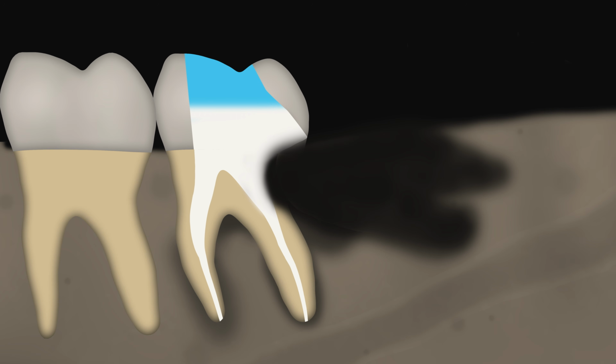Once we can see that area better, we can remove the remaining decay and restore it with some restorative material. I always prefer to restore these areas with resin modified glass ionomer cement, or we may go for procedures like deep marginal elevation.